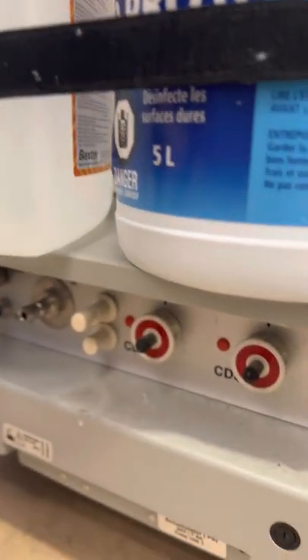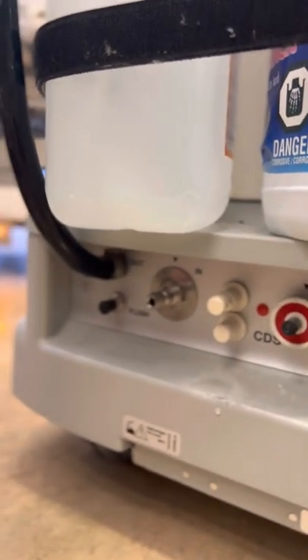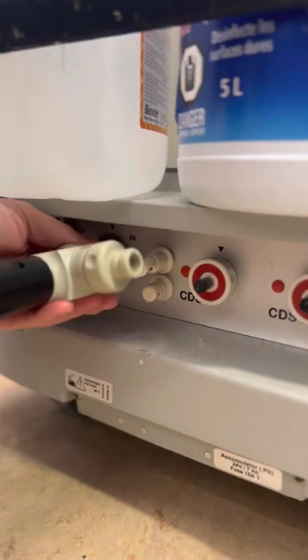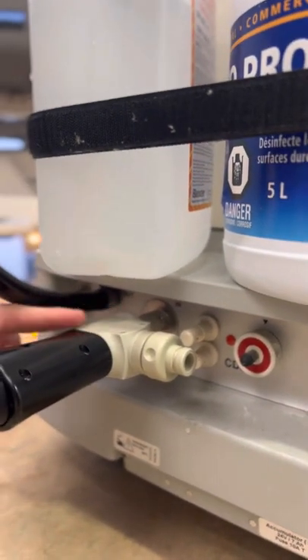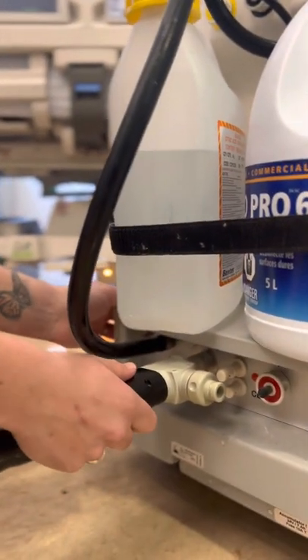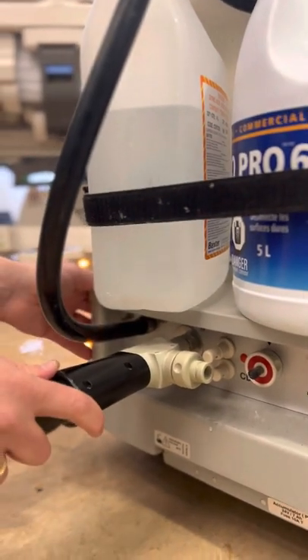From there, you're going to pull back this aspect here and connect it to this port. You're going to pull that and you're going to hear a click. If you don't hear a click, it's not secured properly. And sometimes if you're having a lot of trouble getting that securement, please put the brakes on the dialysis machine — it'll be a lot easier for you.